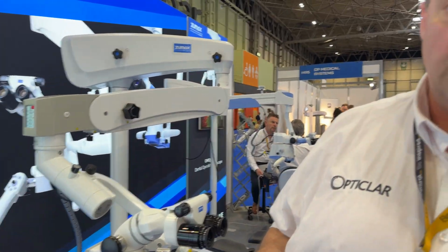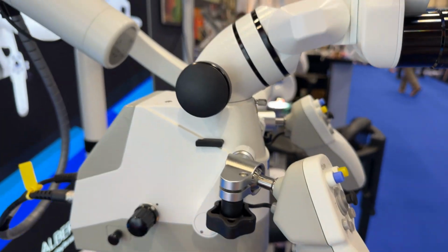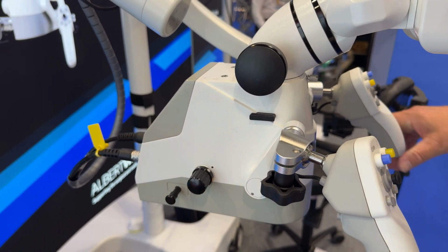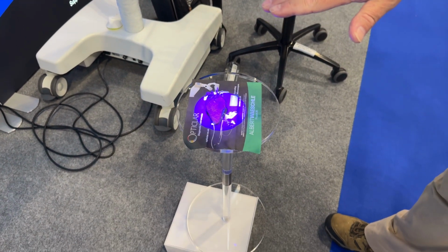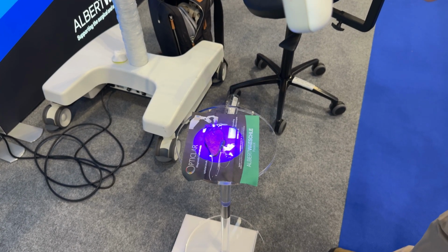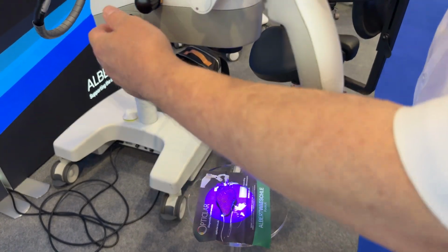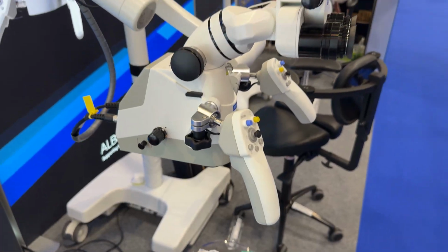Sure. And then there's another option there with lasers, so you can put... That's it. Yeah, I saw that little... Which will be a little switch on there, and you'd pull it out. So on this one, we've got one where it's setting up a different light, and we'll see the image will come back on. This one will show things like cracks and stuff differently. So your light goes to there, and then you move it back in, you're back to your normal light.